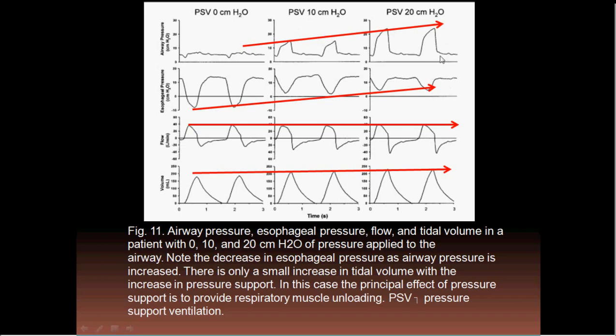This is very important in weaning. When you are going to wean the patients, you just come down with the driving pressure, so the pressure support setting goes from 20 to 10. And look at the tidal volume. The tidal volume is the same. And the same thing also, there is no increase in the respiratory rate. This means that the patient is making good effort.